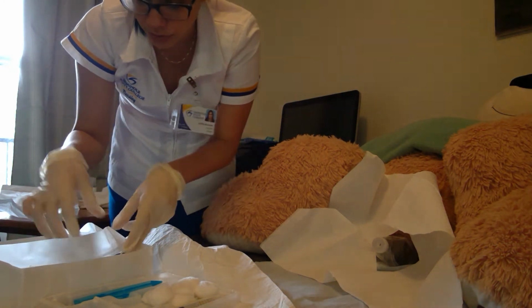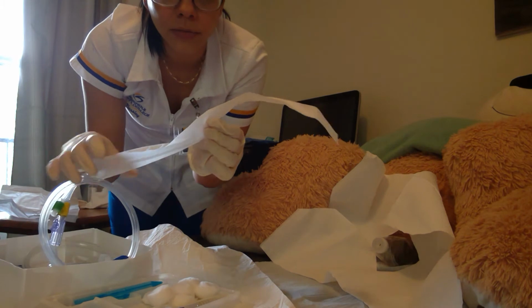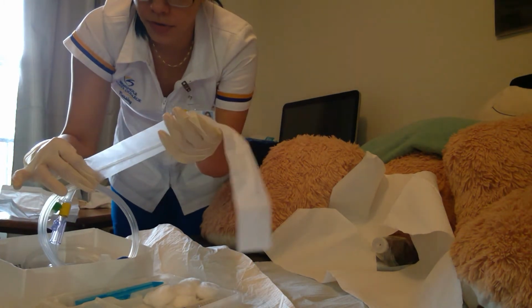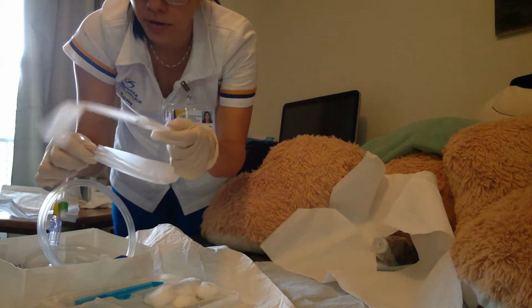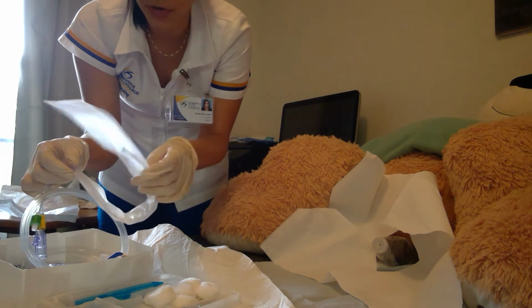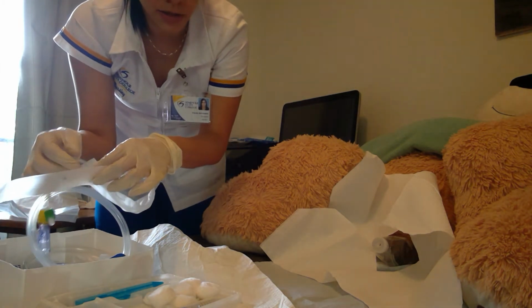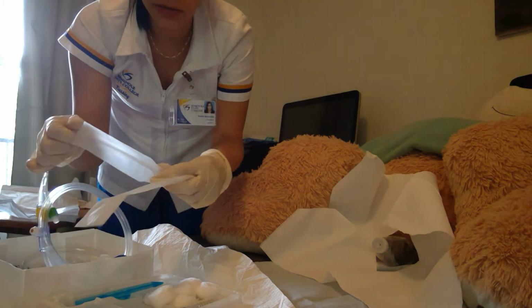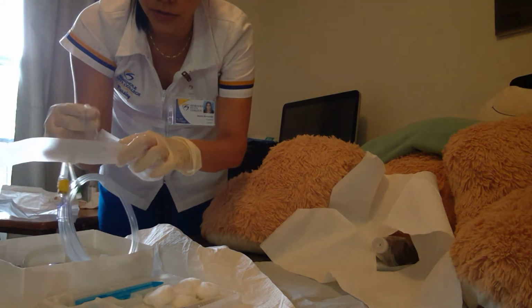Now I'm going to take my Foley bag and the covering. I'm gonna take the covering out. So how I'm gonna do that, I'm gonna roll this part because this is very flappy and I don't want this to go somewhere else. I want it to be in my sterile area. So I'm just gonna roll it with this hand while I take the covering out.